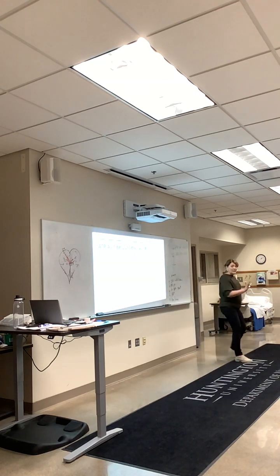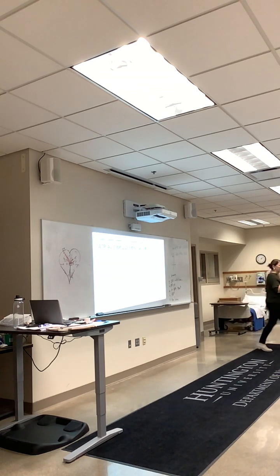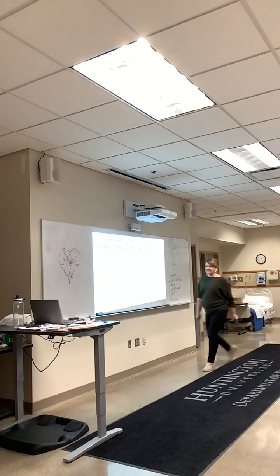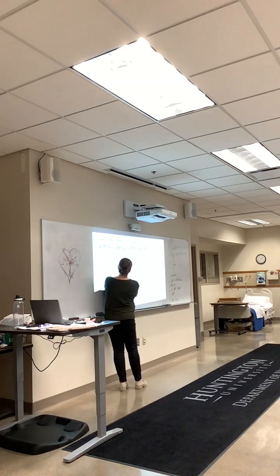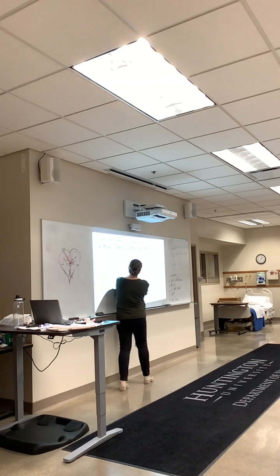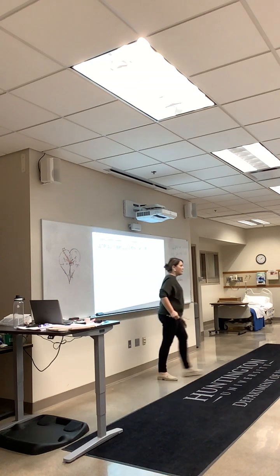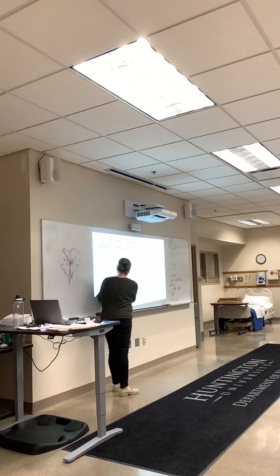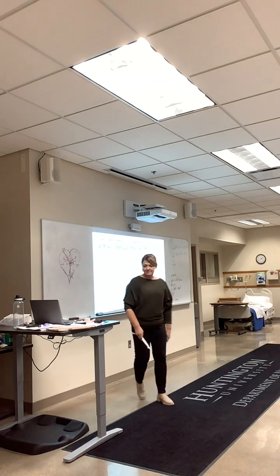I will tell you, I didn't go down my list. The rate goes up. I will tell you, it is always 100% of the time irregular. 100% of the time, it will be an irregular rhythm. I can't march it out evenly. Always irregular. I'm gonna grab my big old calipers again. Here to here, here to here, here to here, here to here. It's not even. And so it will always be irregular. Here to here, oh, should have been there. Nope, okay, this way. Oh, nope, like it's never regular.